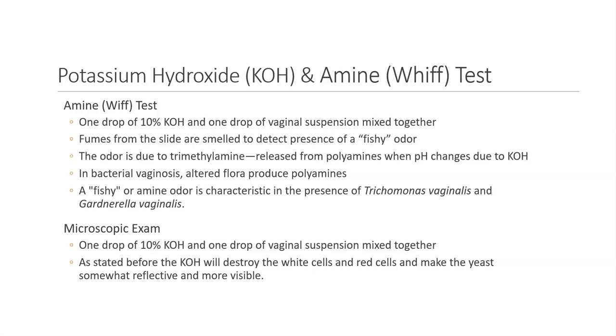The odor is due to trimethylamine, which is released from polyamines when the pH changes due to the addition of the potassium hydroxide. In bacterial vaginosis, the altered flora produce polyamines. A fishy or amine odor is characteristic of the presence of Trichomonas vaginalis and Gardnerella vaginalis.